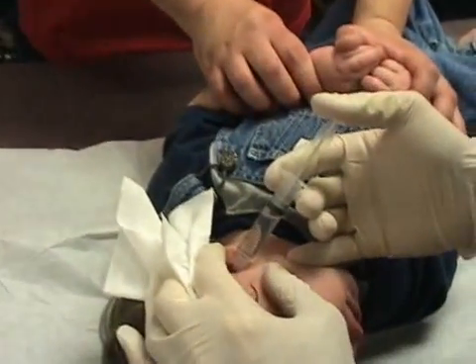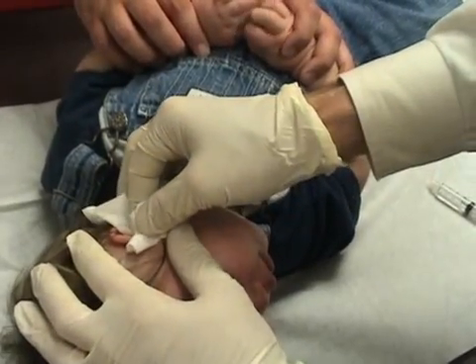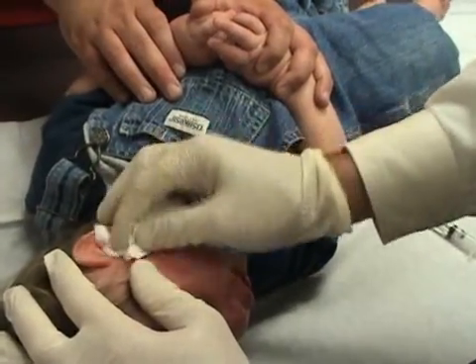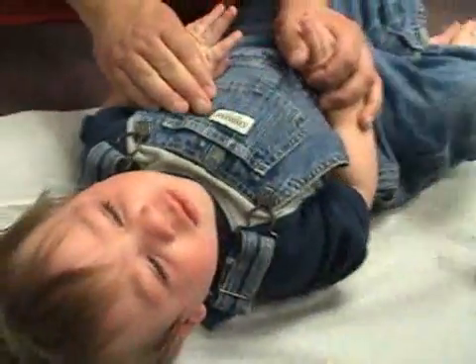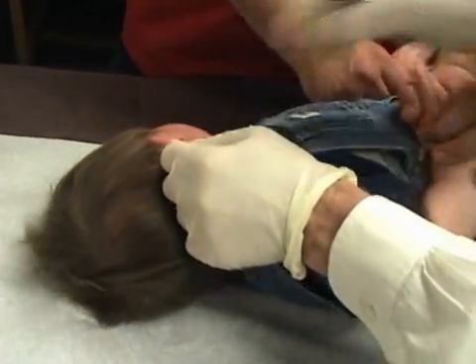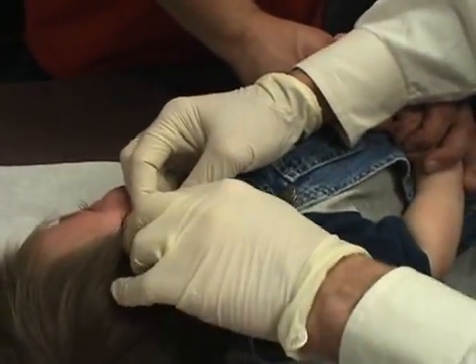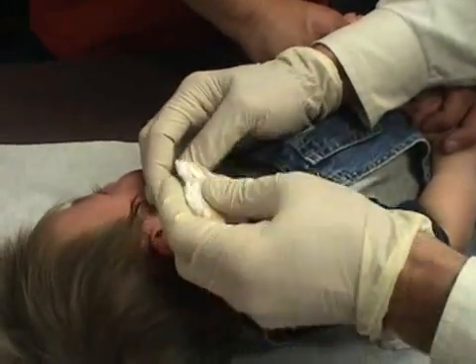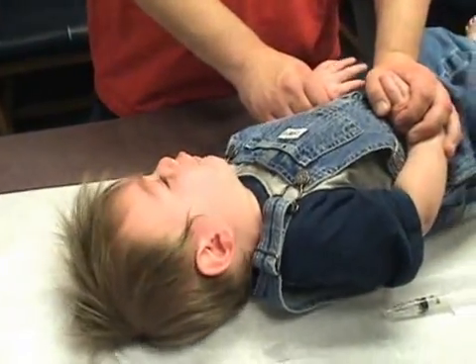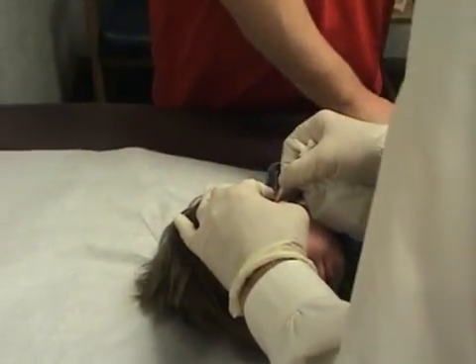I think when I see this much infection in the ear, generally there's gonna be stuff draining for like days. Maybe a little tinged, not a lot of blood, just tinged. Let's put a little more on this side. Now I'd like you to continue to treat him with some peroxide, because as the debris builds up in there it tends to be cleaned out. A little peroxide is okay, and if you want to follow the peroxide by wicking it out again with a cotton — that'll dry it out.